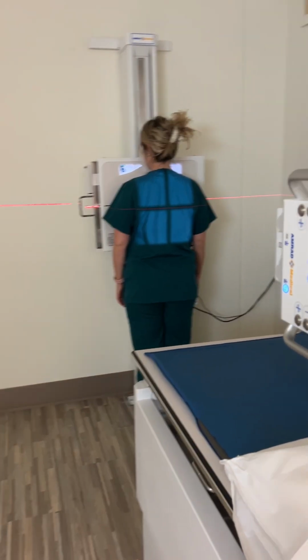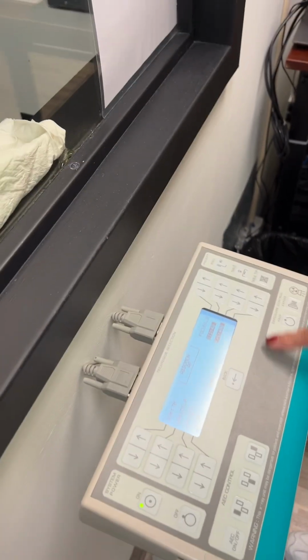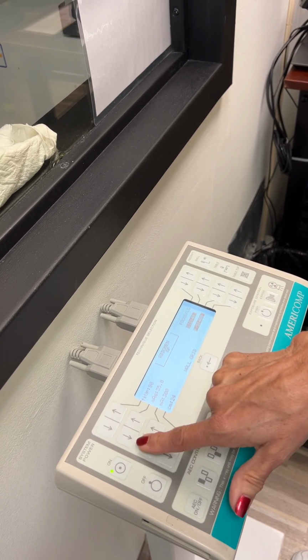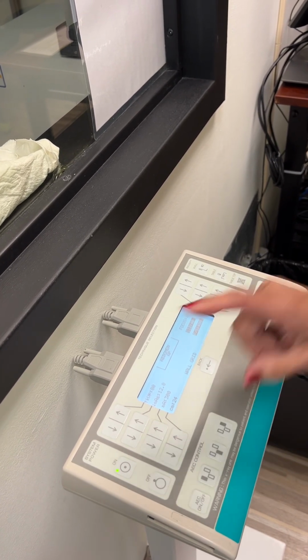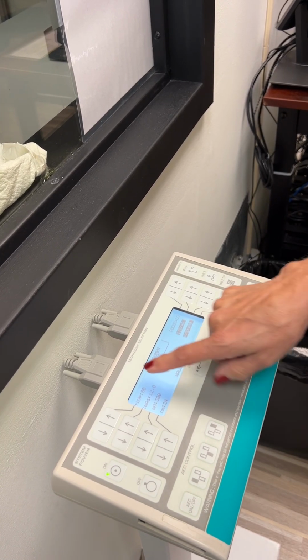Now I am going to go ahead and set this up for an upright abdomen. So I backed out and I went into abdomen. I'm at a 40-inch. I am going to go to the wall bucky though, since we're there. And I'm going to set this at 80 kVp. At 12.5, 12 or 15, I'm going to go with 12 because my patient is Sthenic. So 40-inch SID, wall bucky, 80 at 12.